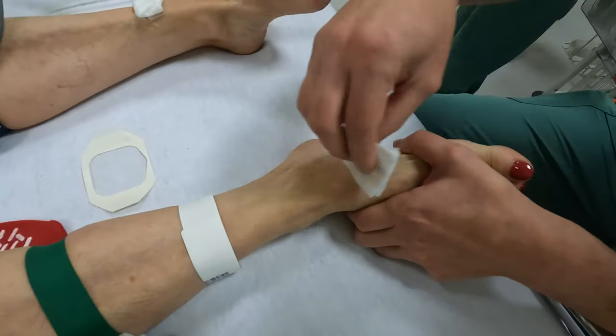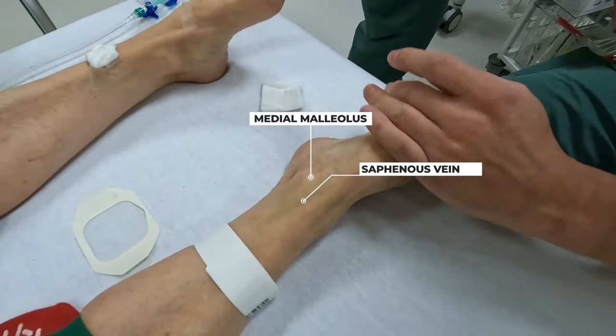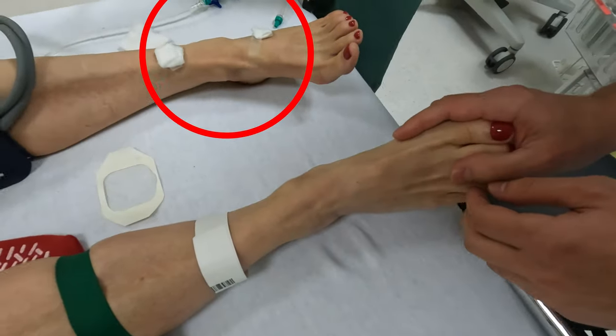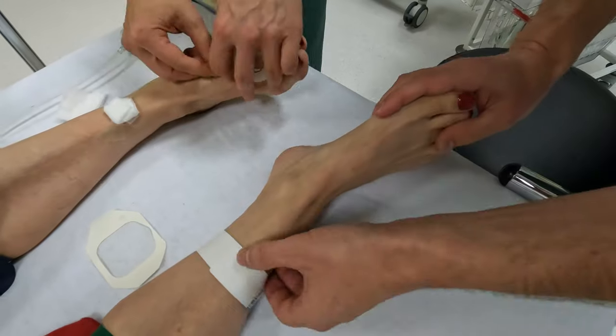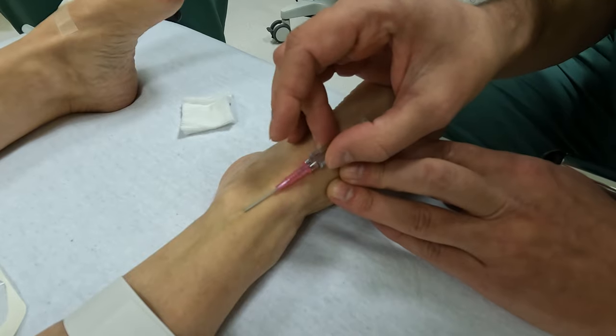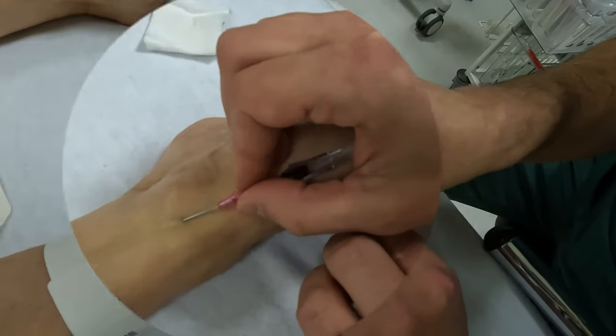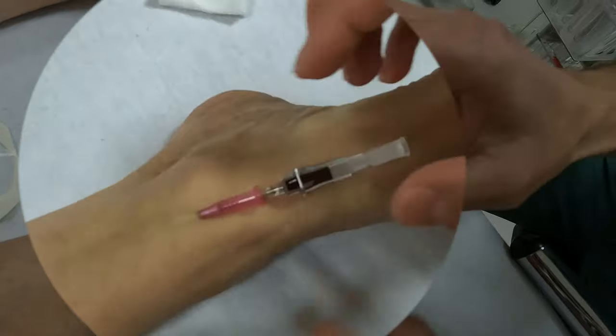Let's see how an experienced practitioner would approach the insertion of an IV into the foot. In this video, we observe the meticulous method employed by a skilled operator attempting an IV insertion of the saphenous vein located just above the medial malleolus. You can see how a previous attempt on the opposite foot has failed, but the experienced operator palpates the saphenous vein carefully to assess its position, direction, and caliber — providing crucial information to guide subsequent steps. The operator then performs a swift advancement of the needle-catheter system into the saphenous vein; this quick yet controlled insertion is essential to prevent the vein from rolling or moving.